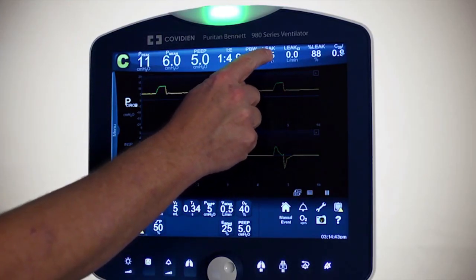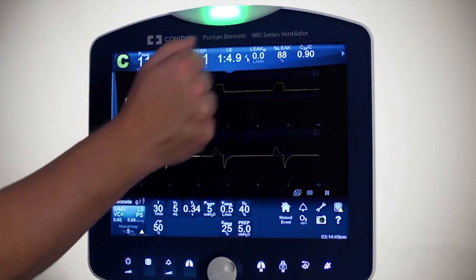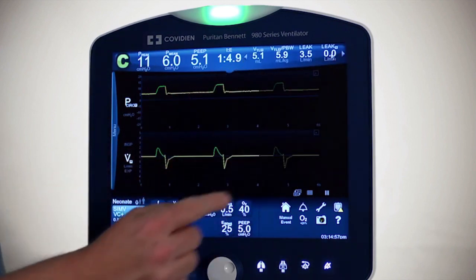The ProxFlow will also display other pieces of information such as percent leak — right now we have an 87% leak — and you also have the C20/C that we talked about in the neonatal portion. Now I want to go in and show you some of the settings.